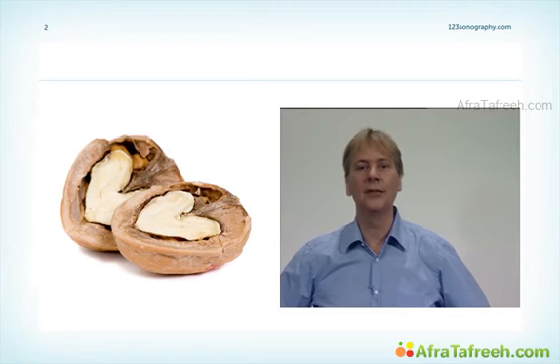Most cardiologists will agree that it is very difficult to make the diagnosis of constriction, probably because it has a very complex physiology. In any case, constriction is underdiagnosed. Still, with the help of echo and with the help of the tips that I will give you in this chapter, I believe we can make the diagnosis in most patients. We just have to be aware of the problem and know what to look for.